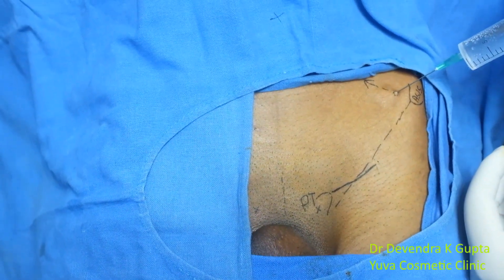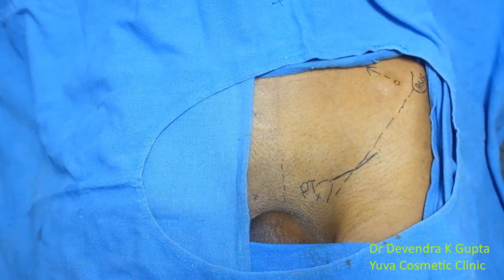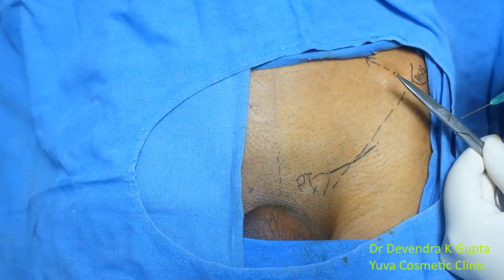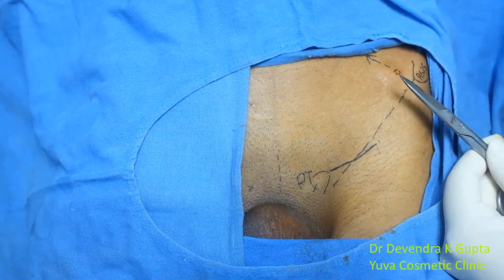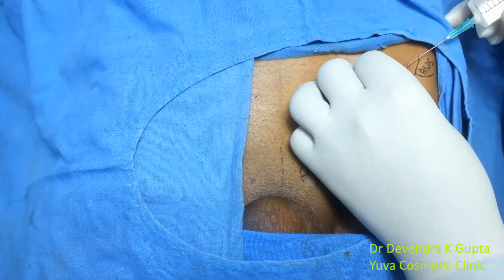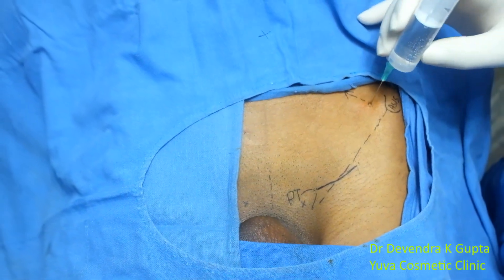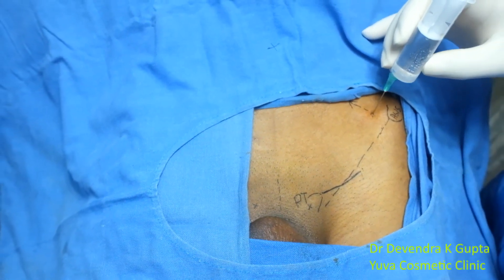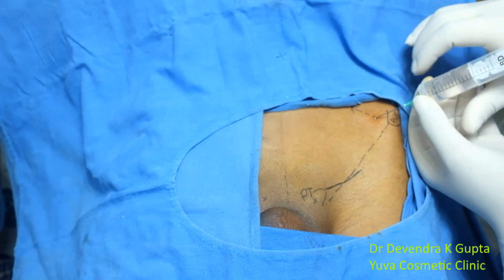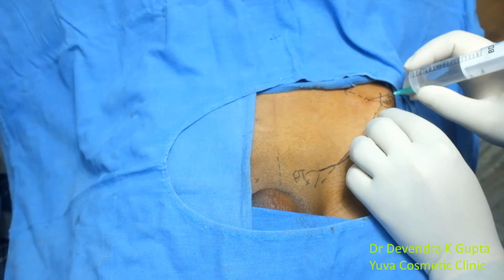Now remove the needle and make it a little blunt so that you can appreciate the puncture from the same previously anesthetized area. You can see this needle is jumping over the external oblique. Just tilt the needle a little bit and appreciate the resistance of the external oblique.